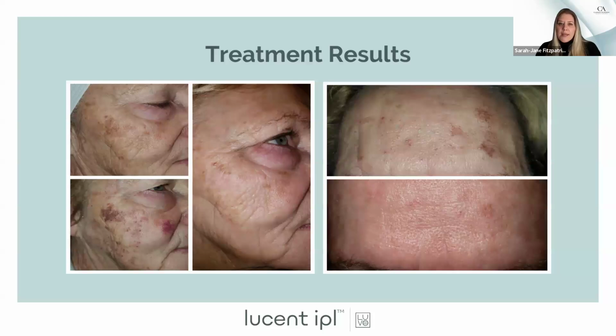Okay, one more here, just in relation to what we talked about. You mentioned using the small square to go up by a couple of joules. When using the 515 single pulse, which is then 4 milliseconds, it won't let me go up more than 12 joules. Well, I have the simulator right here, so why don't I bring this down and let's take a look.